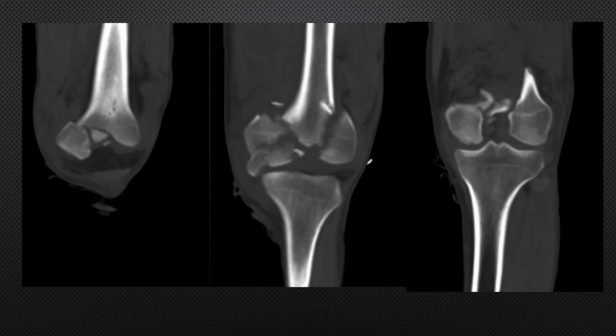Now we go towards the coronal cuts. Now this is starting from the anterior to the posterior. This one is anterior, again a similar picture, the comminution on the notch part, medial side, and the lateral side appears to be a bit simple. And on this cut, that means in the central part of the knee joint, we again see the comminution on the medial side, the comminution on the notch part, and the lateral side appears to be simple.